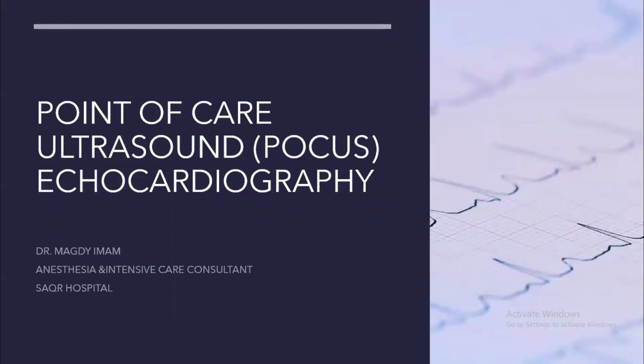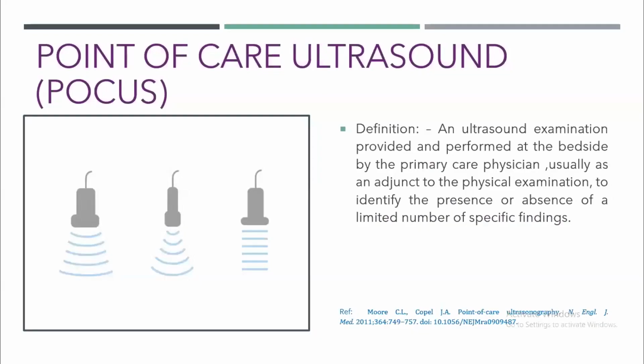Okay, good evening, everyone. My topic today is point-of-care ultrasound echocardiography. I'll try to make it very simple. It is a long learning journey, but I will try to keep it simple and avoid complex medical words. We're talking about the basic point-of-care ultrasound, the basic views. So first of all, what is the meaning of point-of-care ultrasound, sometimes called focused ultrasound?